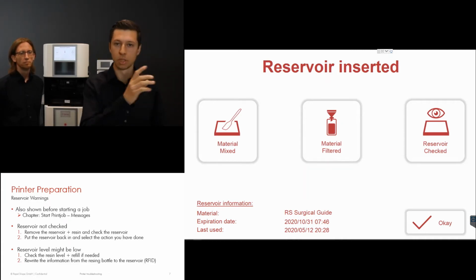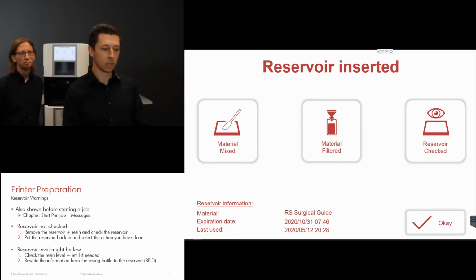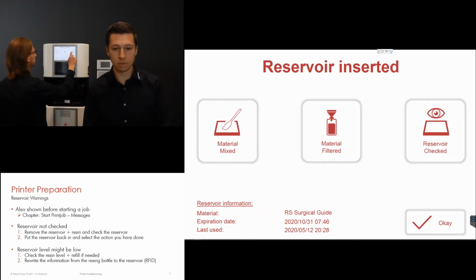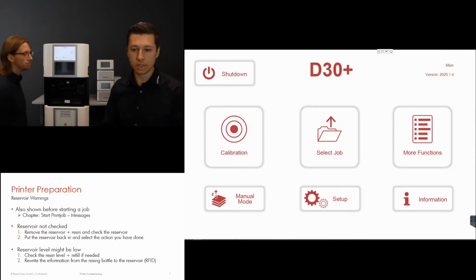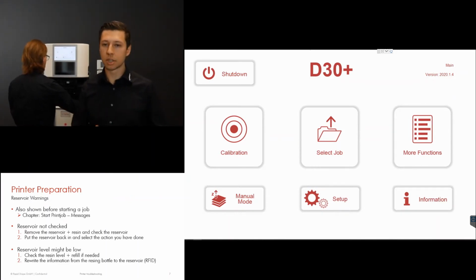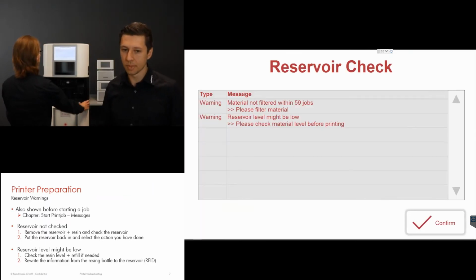If you have done this, you just reinsert the reservoir, click on confirm when the message appears, and now you say which action you have done. Reservoir check, or in this case you have done it. Exactly. So if Robert has checked the reservoir, he clicks on check reservoir. So now the reservoir is checked. We have seen there's some other error message. So what we will do is remove the reservoir again and put it back in to see what we still can solve.